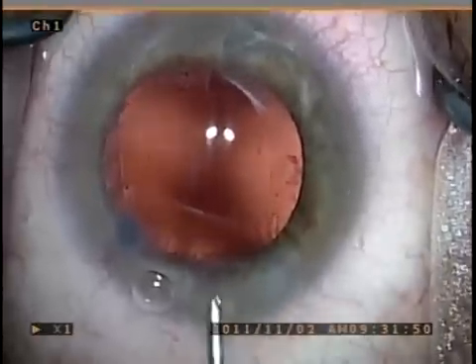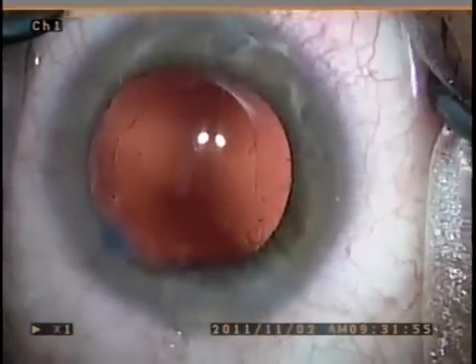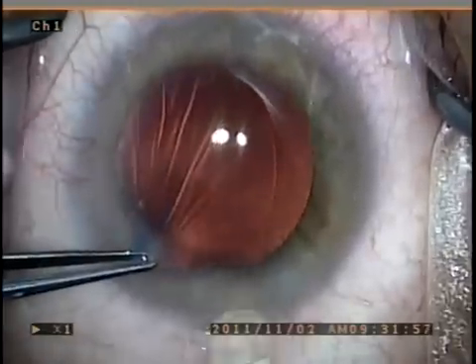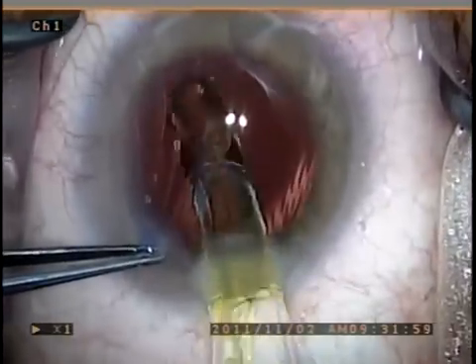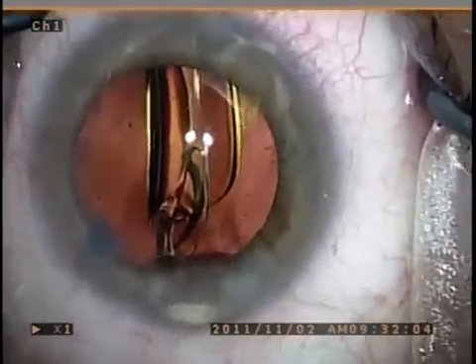The bag is then re-inflated with viscoelastic in preparation for lens insertion. And then a foldable acrylic lens is then placed into the capsular bag.